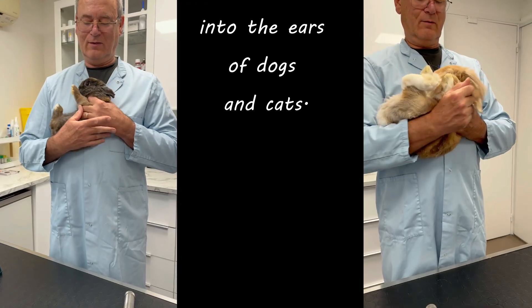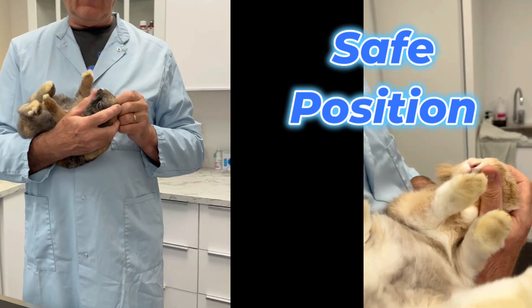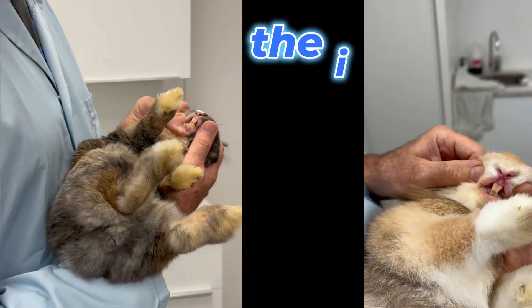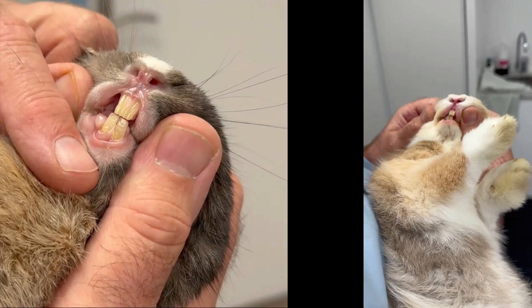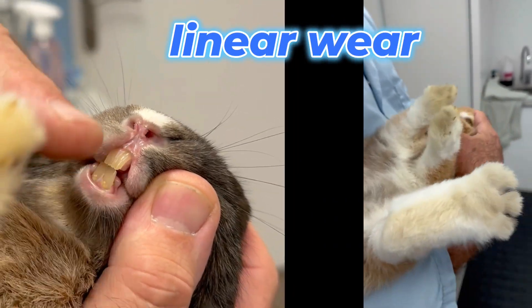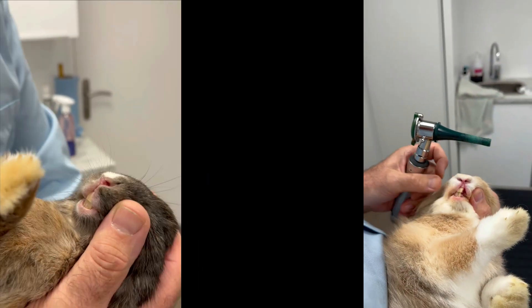The rabbit here and the otoscope there. I hold it like this in a safe position, and it will show us its little teeth. Like this, we have a look first at the incisors and check that they are straight and horizontal. If they are slanted, this is not good.